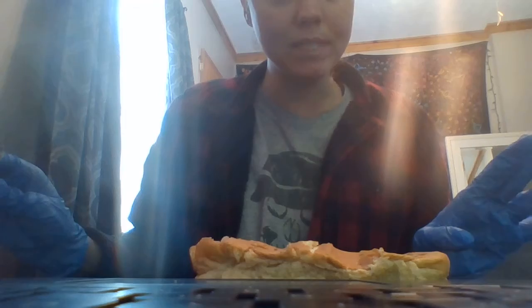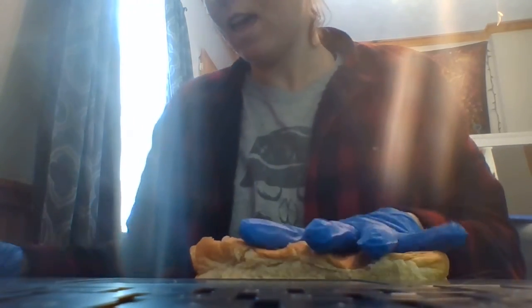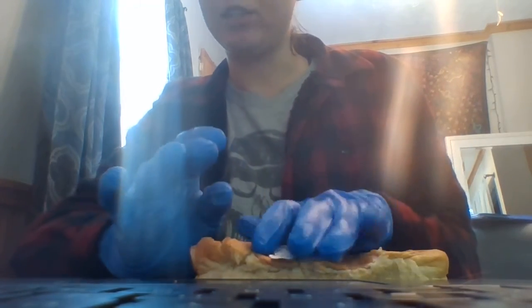I will not recap this needle. I will put it in the sharps container. I'm going to put gauze on my patient's skin and apply a little pressure. Okay. I'm going to remove my gloves. I'm going to wash my hands.